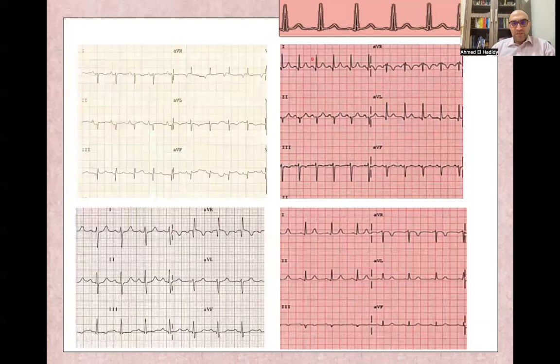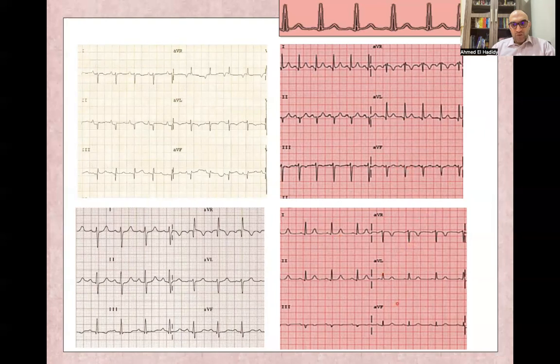To apply this rule to the ECG shown: if lead I is positive and aVF is negative, this is left axis deviation. If both are pointing up, this is normal axis. If lead I is negative and aVF is positive, this is right axis deviation. If both leads are pointing down, this is extreme right axis deviation.